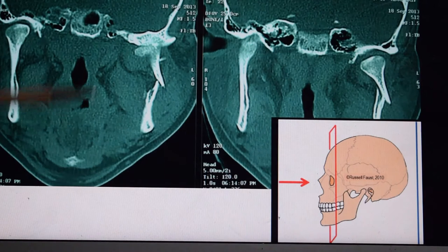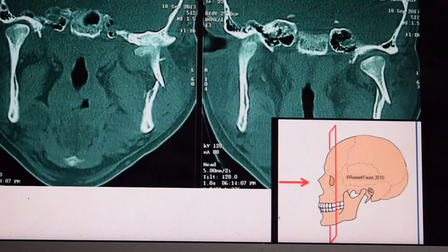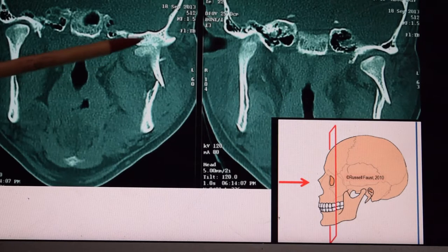This is the coronal view of the mandible. In this view you can see that one side of the mandible is intact, but the other side is fractured at this location and the upper segment of the condyle is displaced laterally. Here you can see the lateral displacement of the condyle.